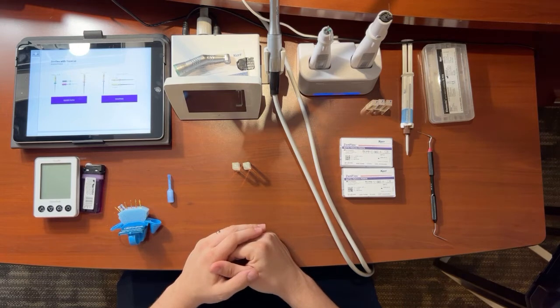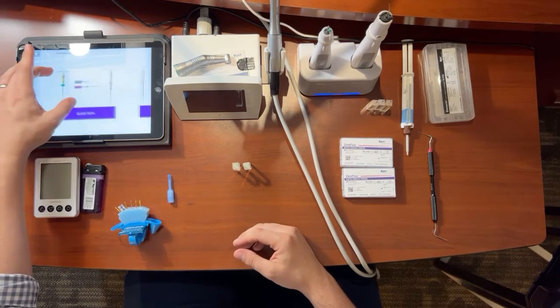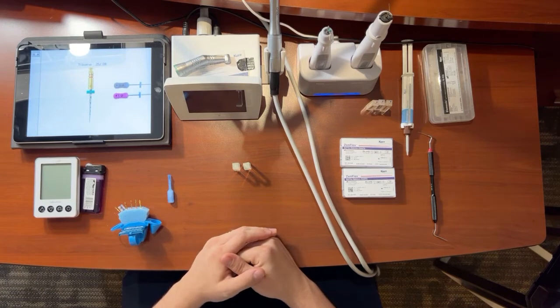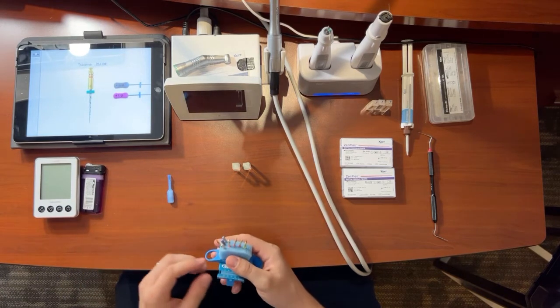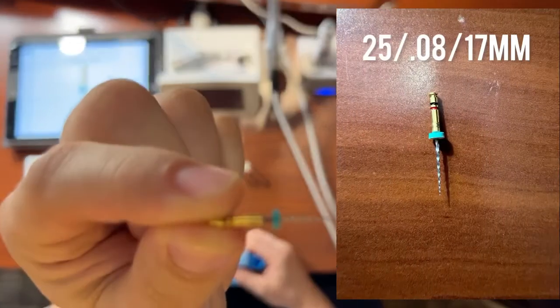Next, after you've accessed, you're going to do your glide path. So this is where everything starts to come into play. Right over here, I'm going to show you this first orifice opener file. This is our Traverse orifice opener. It's a 2508 17 millimeter file.